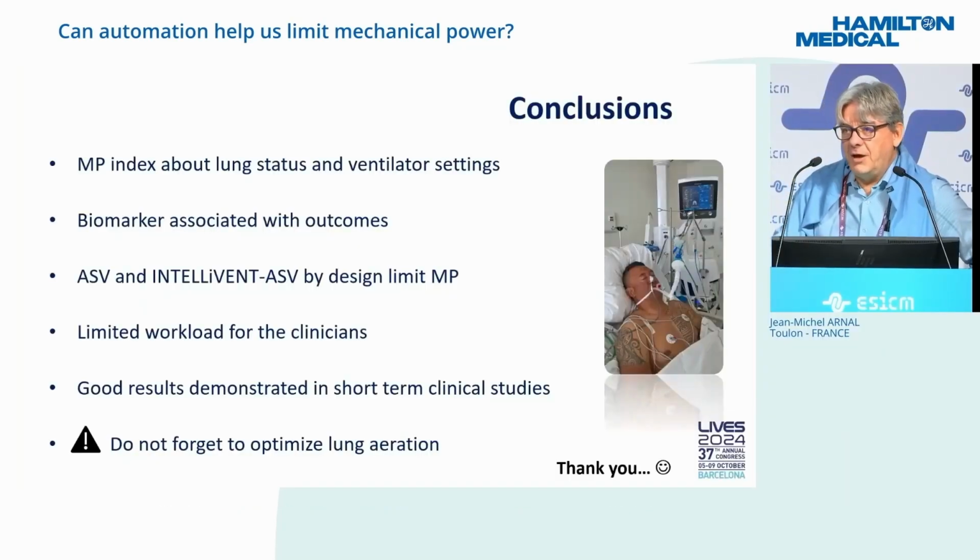Well, I thought that respiratory rate was not relevant in the past, and maybe we have to accept that it is relevant, and that when we set a ventilator, we overventilate most of the time, and we could do the same thing with lower respiratory rate. And my experience with closed loop is that each time you activate a closed loop, you realize that you are doing too much. The same for FiO2. You realize that you can ventilate the patient with lower FiO2 and here a lower respiratory rate. Will it change the outcome? Let's see. We'll see.